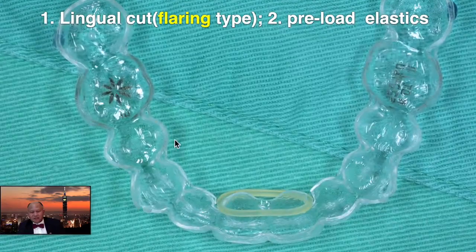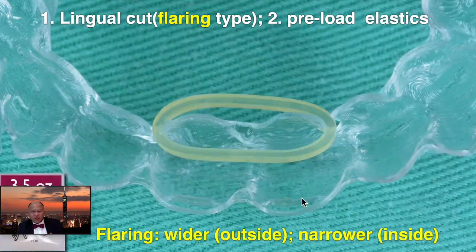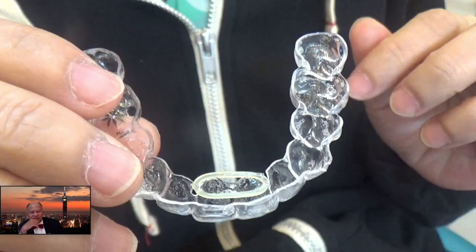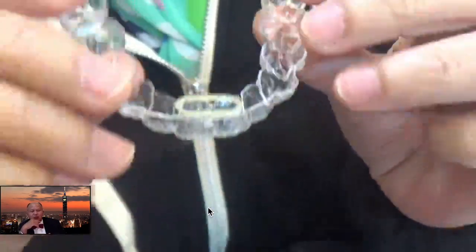First, you have this lingual cut. When you do this lingual cut, make sure you do a flare type. What I mean by flare type is you cut it wider outside and narrower inside. Otherwise, it will be difficult to hold this elastic. And have the patient preload this elastic. You have to cut it by yourself, not by myself, by my assistant, because the aligner company doesn't cut this for you. So you have your assistant cut it. All my assistants know how to cut it. It's easy.